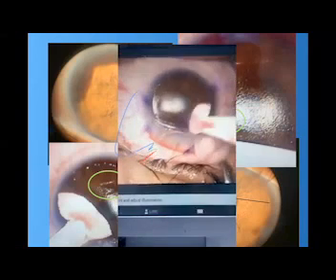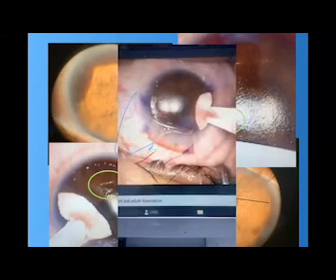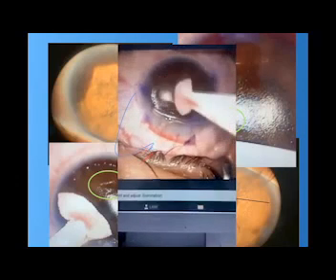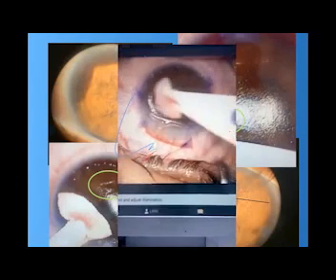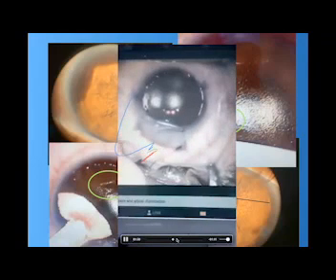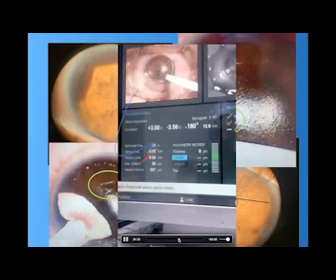As you see, the bed is okay, but showing the scar depressions. Okay, there is no need to complete the video because of the laser ablation.